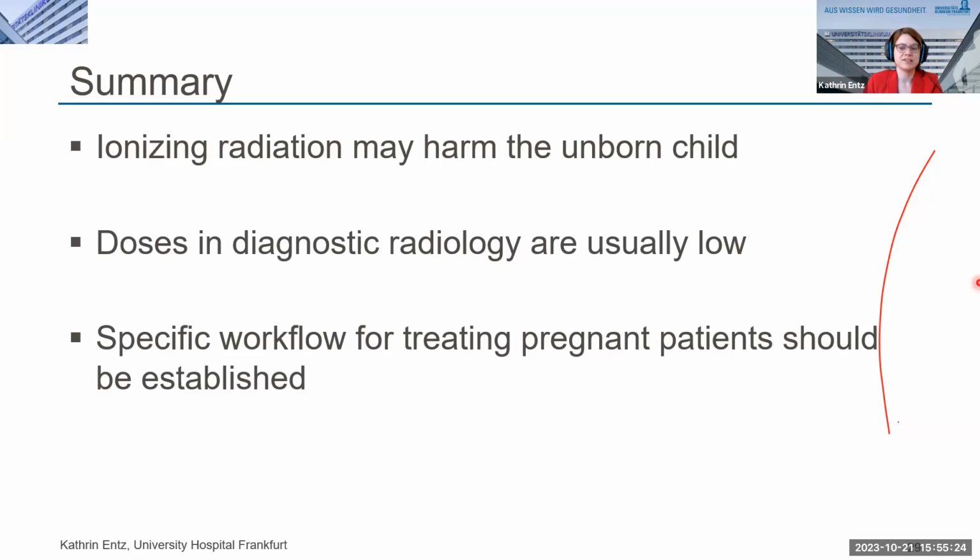And for those cases where we have to image pregnant patients, it's advisable to establish a certain workflow so that everyone knows what to do and how. For example, also to talk to a patient. In our checklist, we also have certain wordings for the radiologist so that they know what to do and how to explain the risk to our patients.